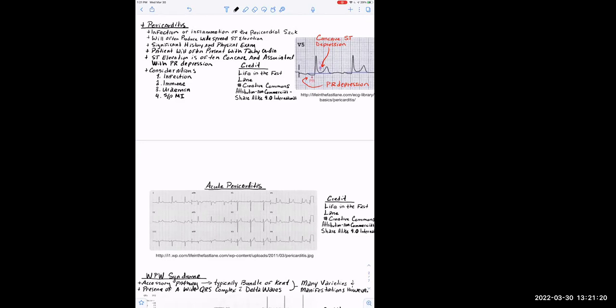I should have gone ahead and drawn this ahead of time, but I'm not really going to try to draw it here now because I'm just not the same kind of artist that Chris is. But I will tell you, you usually see three stages of change. Maybe you can mentally think about this, or we can revisit this when we look at our EKG that's coming up. Usually in stage one, you'll end up seeing a concaved ST segment. And again, think about that kind of smiley face. So in the beginning, when the person first gets ill, usually that ST segment will actually concave.